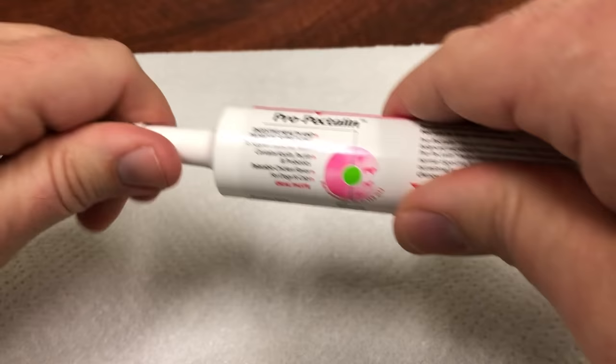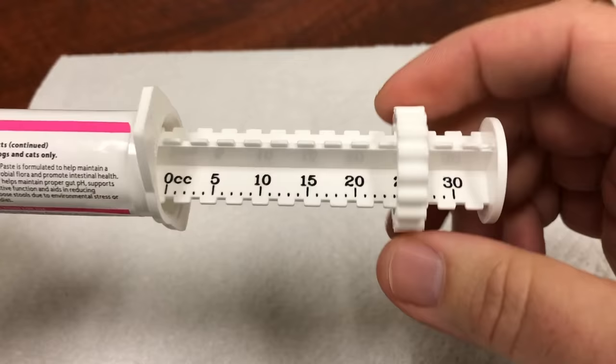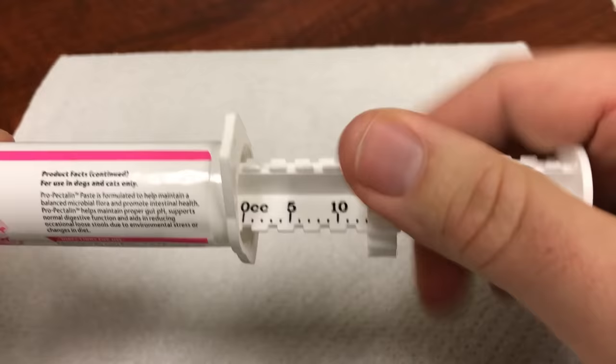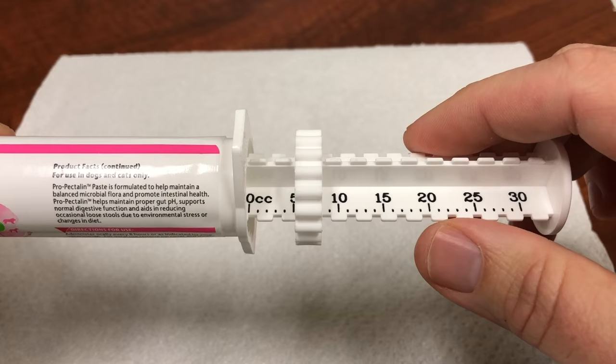First, remove the cap off of the syringe. Next, twist the syringe ring counterclockwise all the way down to the 5 hash mark. When looking at the syringe, the ring should be on the right side of the number or dash.